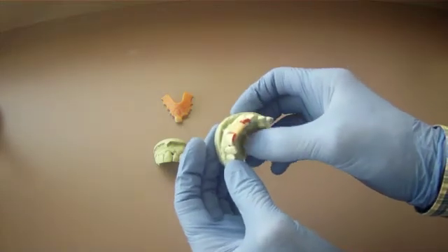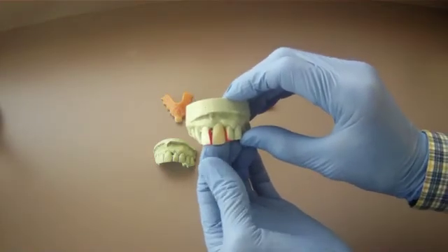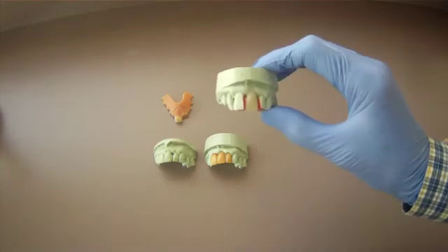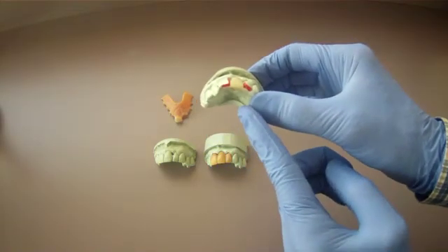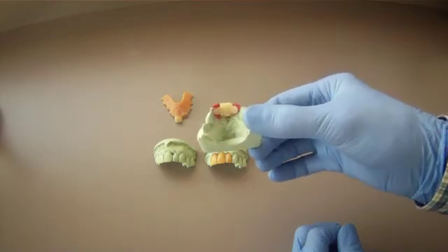It's adhesive, and it's a very simple process, one that most people prefer over implants or a flipper or the traditional orthodox bridge work. So with that, we conclude our presentation of the alternatives available for most people and single tooth replacement. This can be done too for several teeth, sometimes 3 or 4. That's a bit risky. They can be done in the posterior or the back of the mouth with single molars, but sometimes you can do a couple of teeth in the back too. It depends on the circumstances.